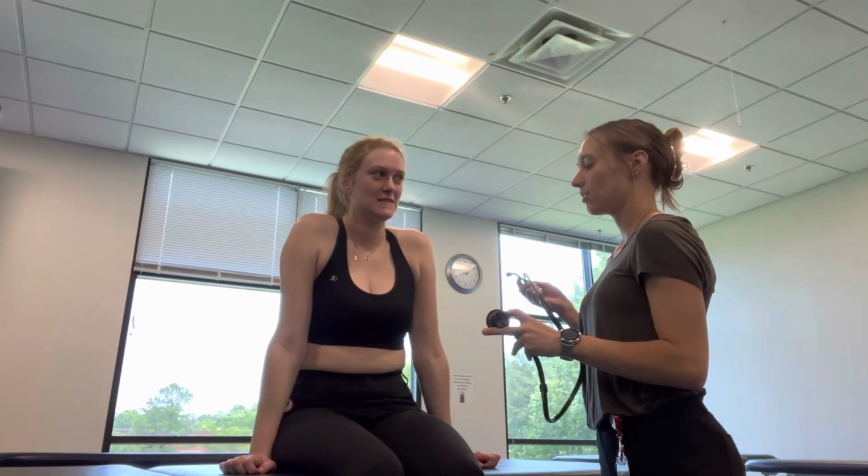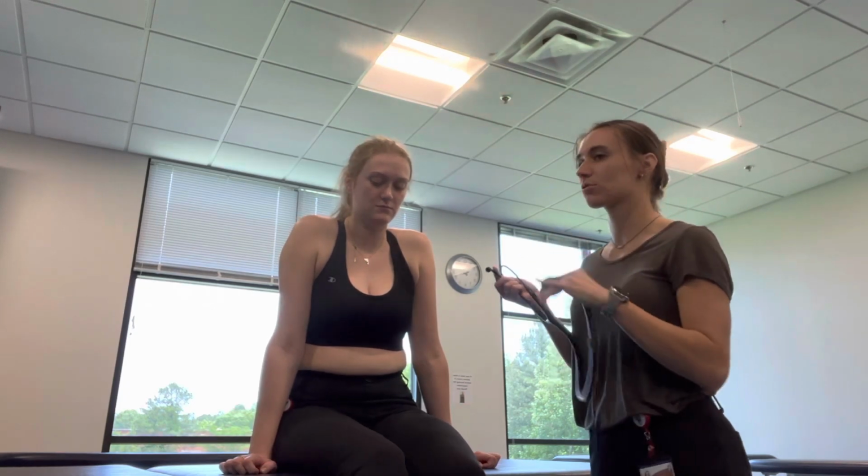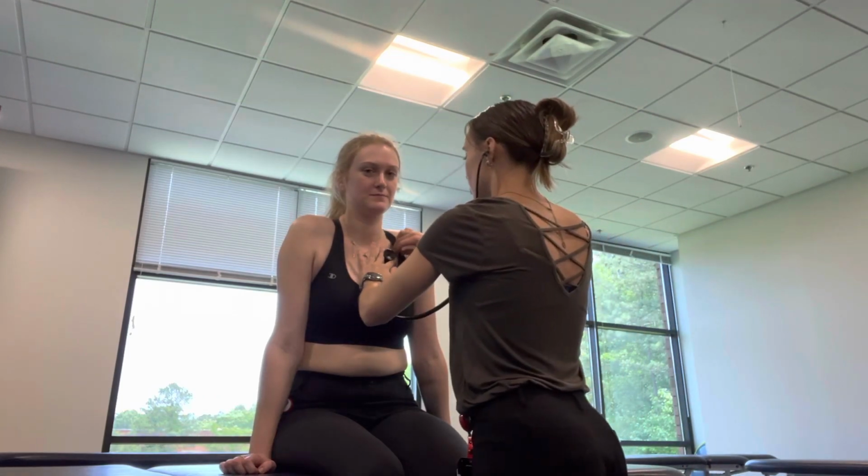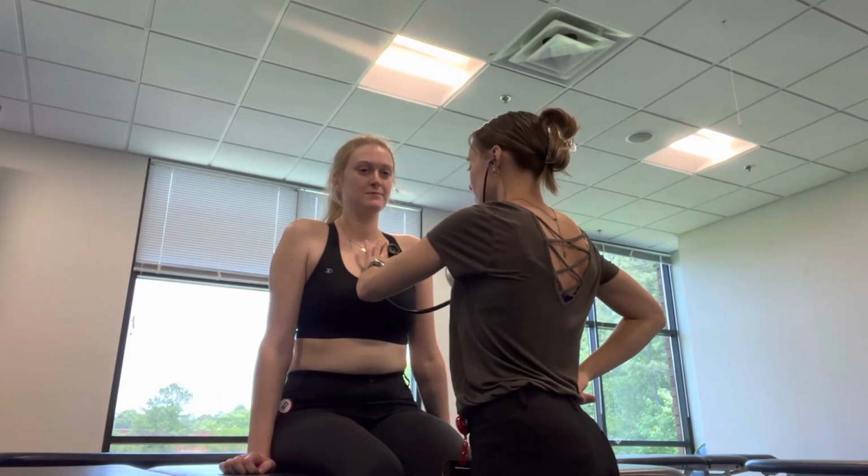Okay, now we're going to do lung sounds. Okay. So I'm going to do, I'll do both sides. Okay. And the first one, I'm going to have her go through a whole breathing cycle, and then the rest of them, I'm just going to, okay. And same thing on the back. So we're going to go through a whole breathing cycle. So take a deep breath in and breathe out.